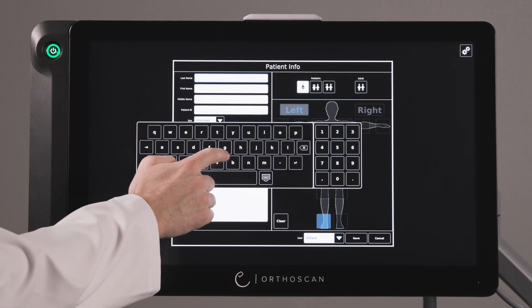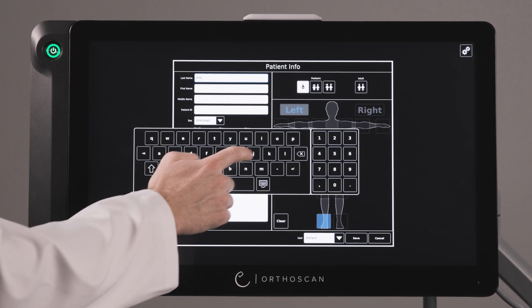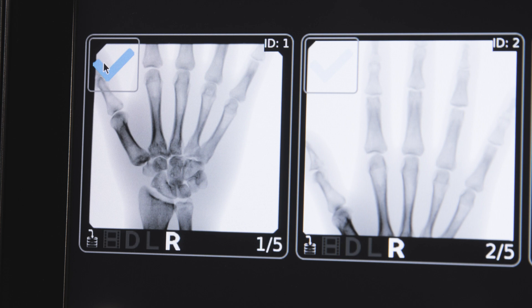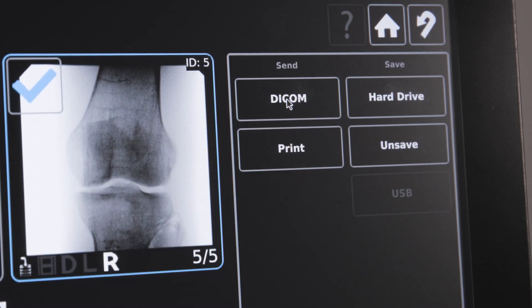By integrating the monitor, CPU, and virtual keyboard, we eliminate the need for a physical keyboard, creating a seamless tablet-like OrthoTouch experience. After each exam, easily review, save, and transfer images via the intuitive OrthoTouch display, fully integrating with your PACS system.